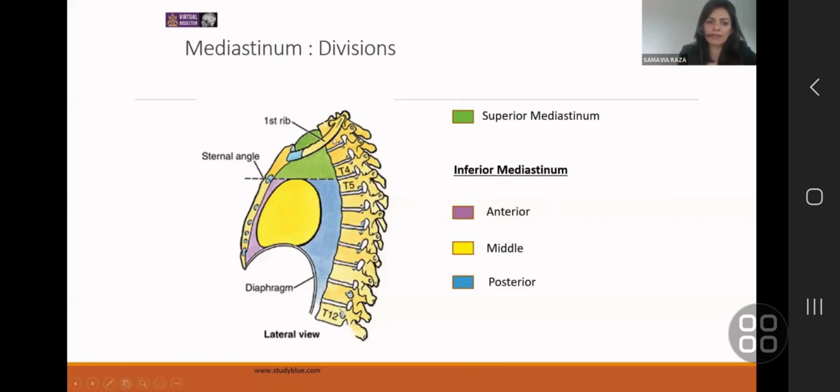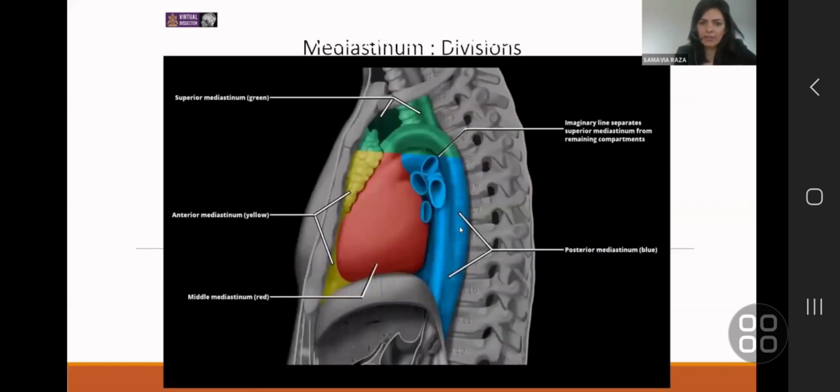So if the bulk is sitting here and it's extending there and extending there, I would think, what is pathological? What is a normal structure in the superior mediastinum? And what is the pathology that can arise from it? And that's basically the whole point of differentiating the compartments, is for you to understand pathology, because the pathologies are distinctly different. Again, on CT, some people ask, oh, is the aorta in the superior mediastinum or the middle mediastinum? Well, it depends on how tall you are.